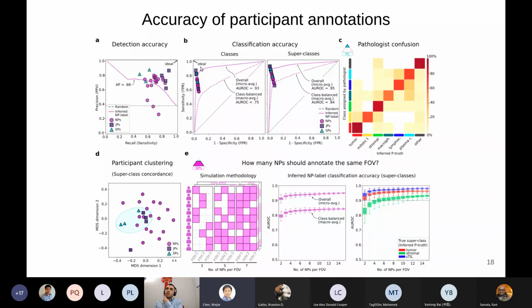And that's what we're seeing here, this ROC curve. So what's the unit of analysis here? Is it pixel-based? You're looking at it based on the segmentation truth, you're looking at what's the true positive, false positive here? Right. So this is classification accuracy. Everything is at the level of individual objects, individual nuclei.